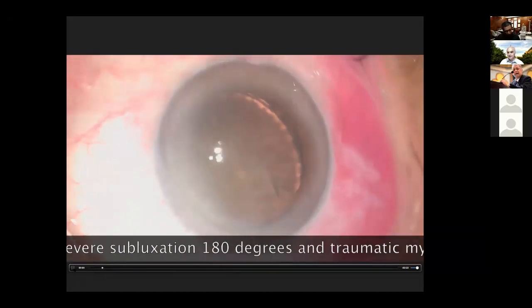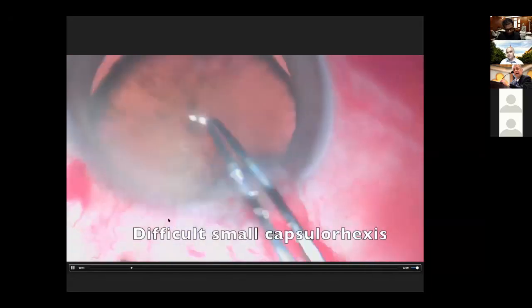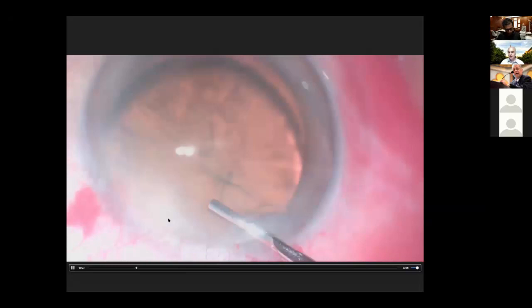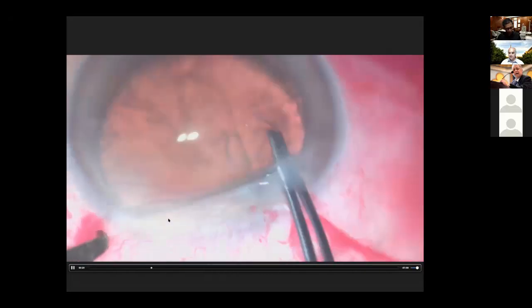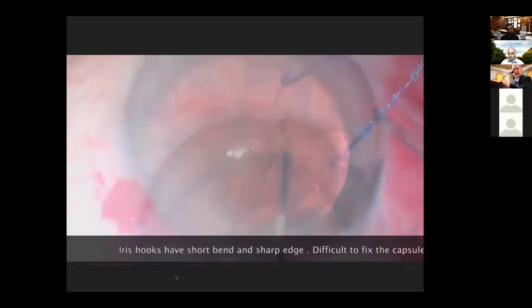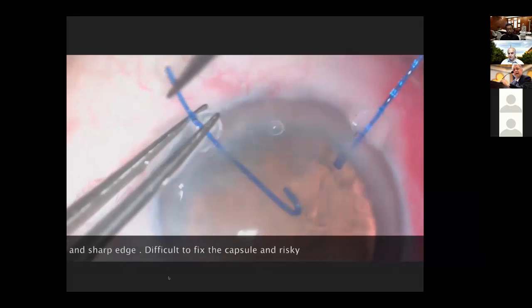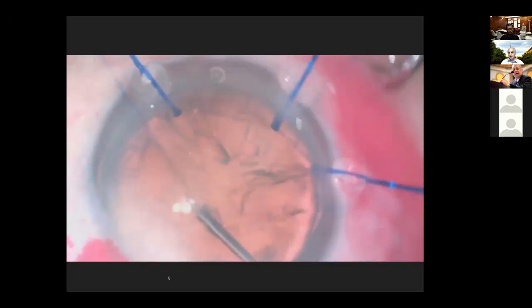The lens is clearly subluxated. You can see the folds in the anterior capsule and you can see the edge of the capsule is almost 180 degrees. So you have to be very careful. Use viscoelastic all the time to make a small but wide enough capsular access. Here I'm going to use the iris hooks, although now I don't prefer to use them to hold the capsule. We'll see why afterwards. The best is to use capsular hooks because they are longer and more blunt.